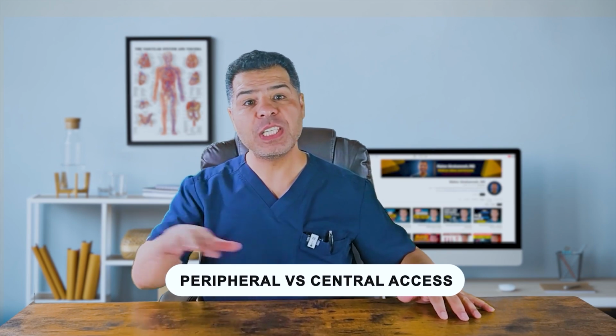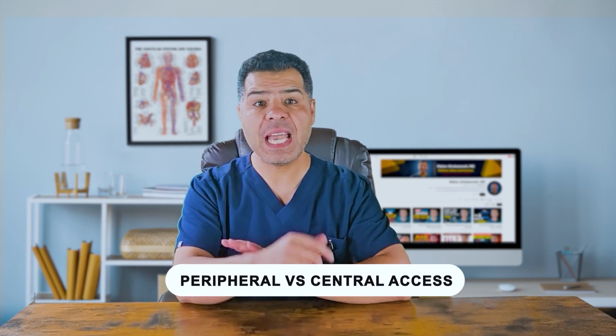Today we are breaking down 5 essential things you need to know about central venous accesses before you start your inpatient rotation. Let's get started. Venous accesses come in 2 main types, peripheral and central.